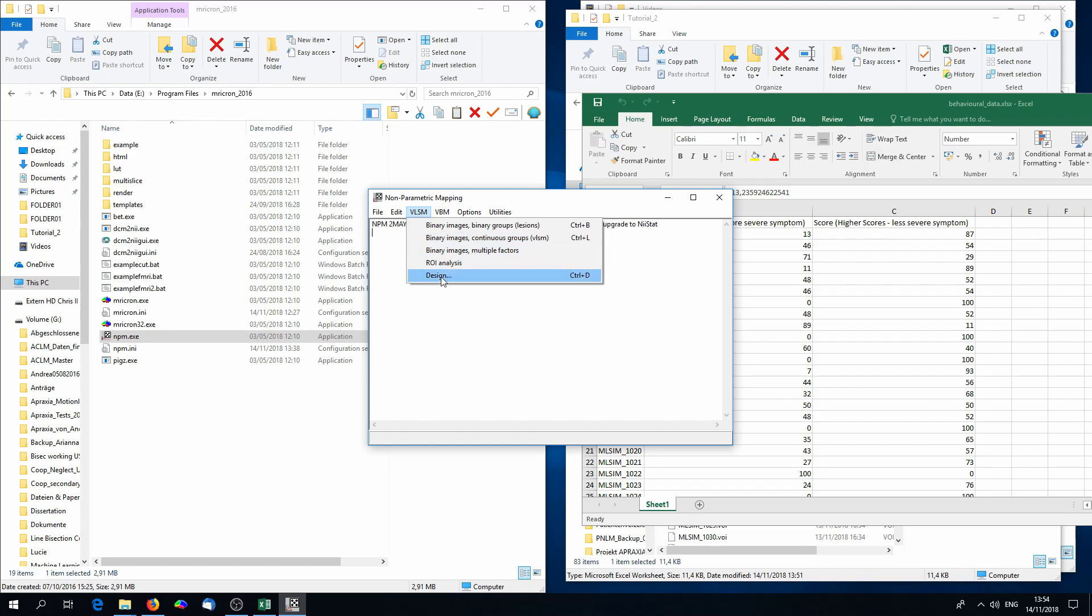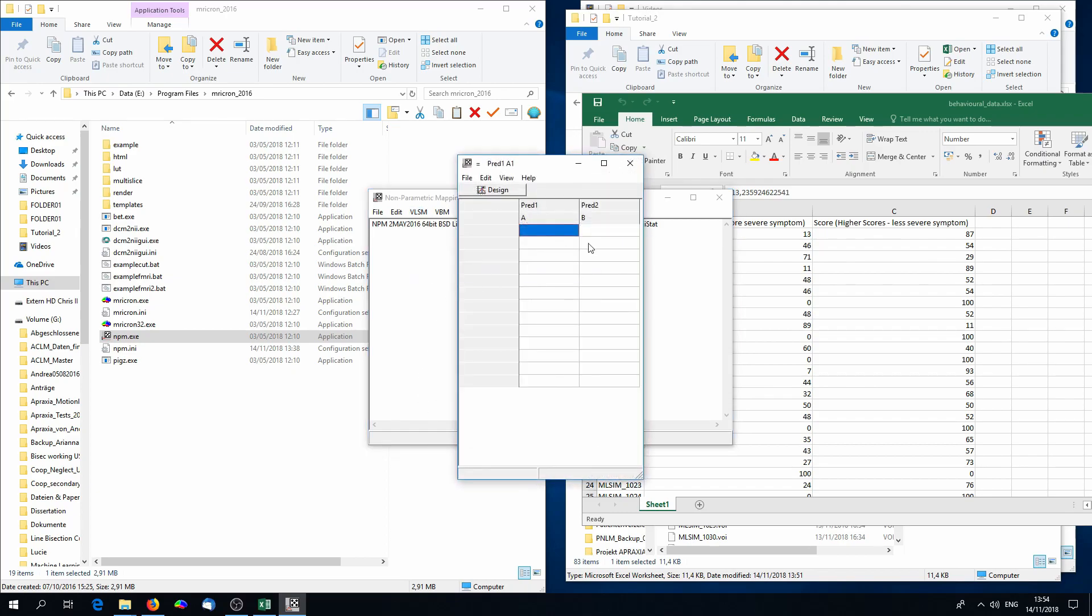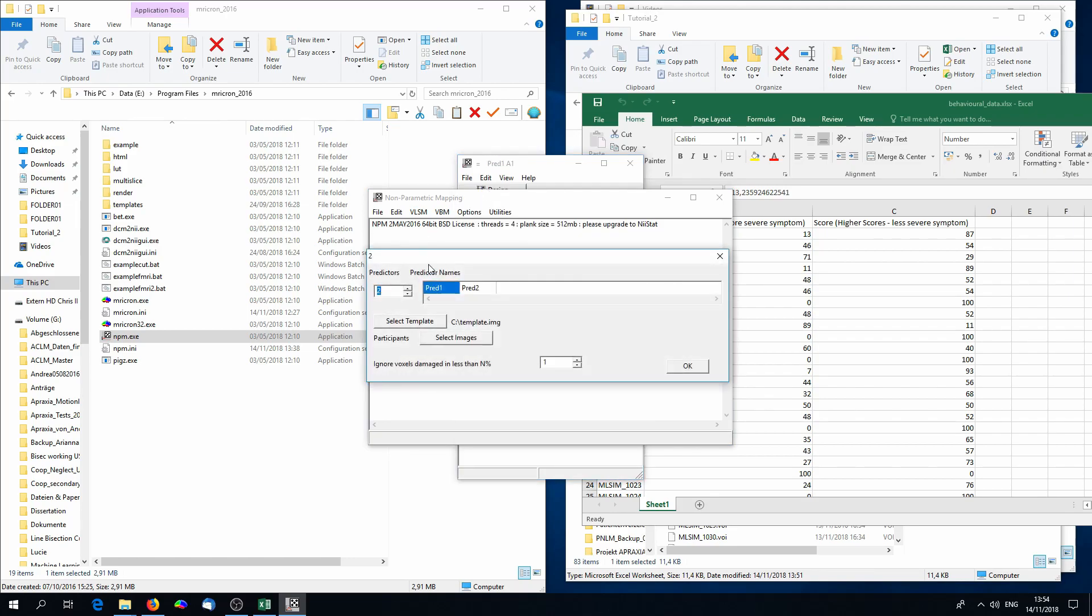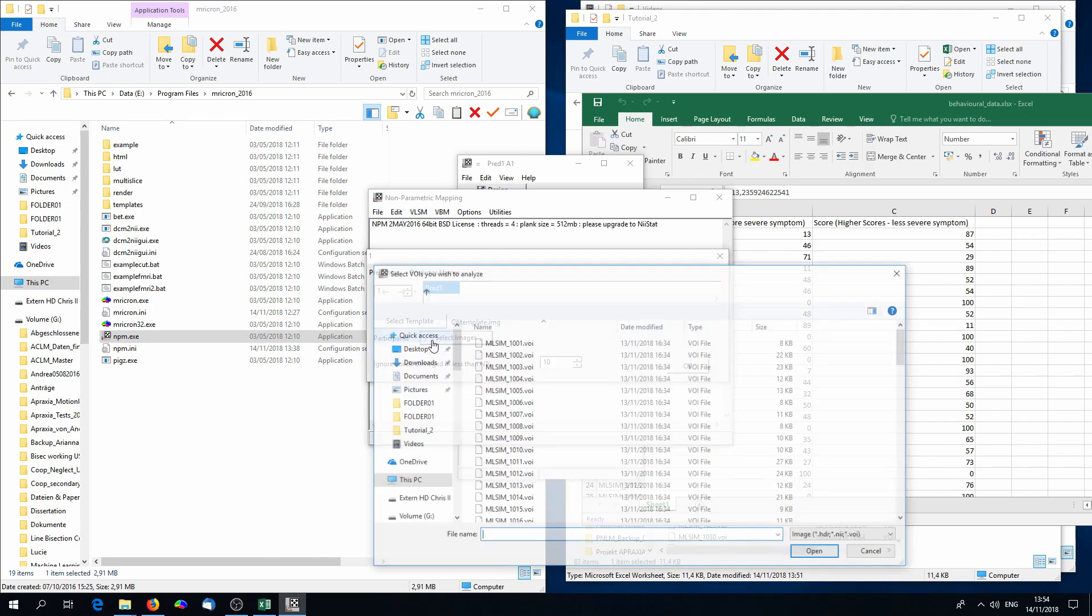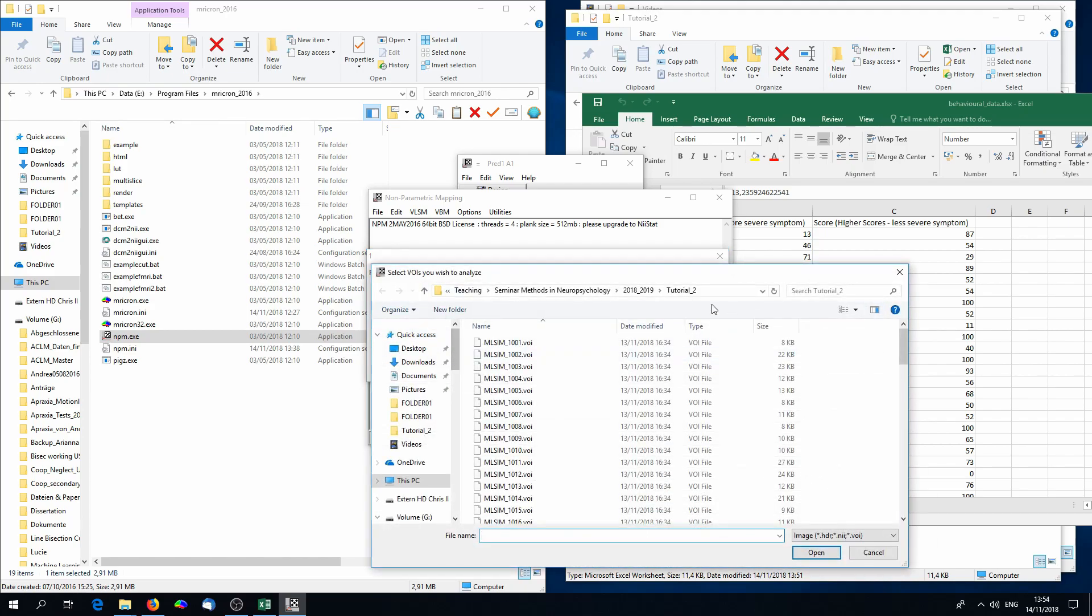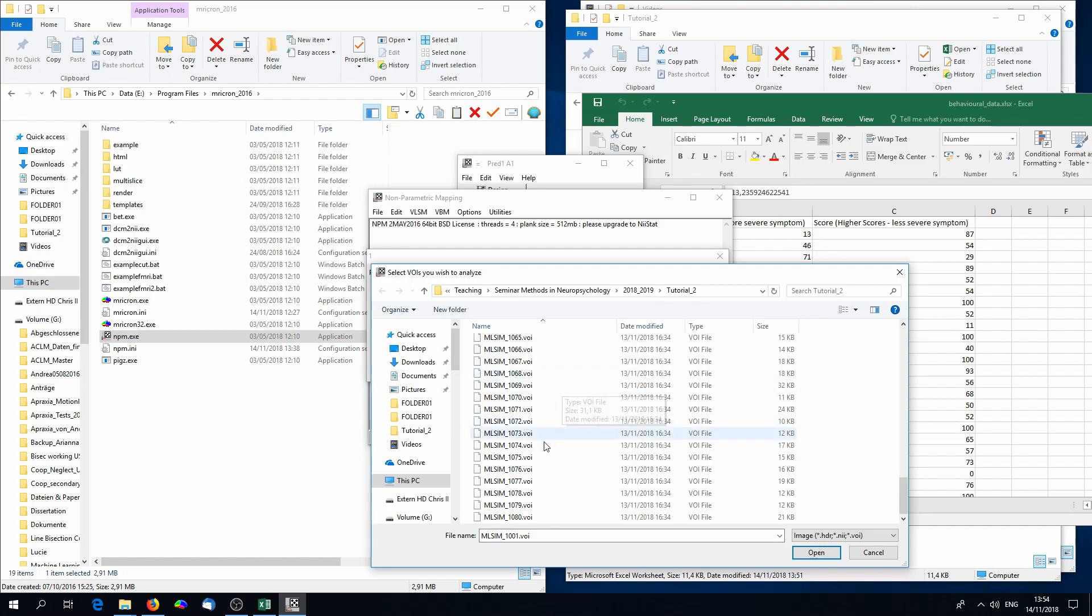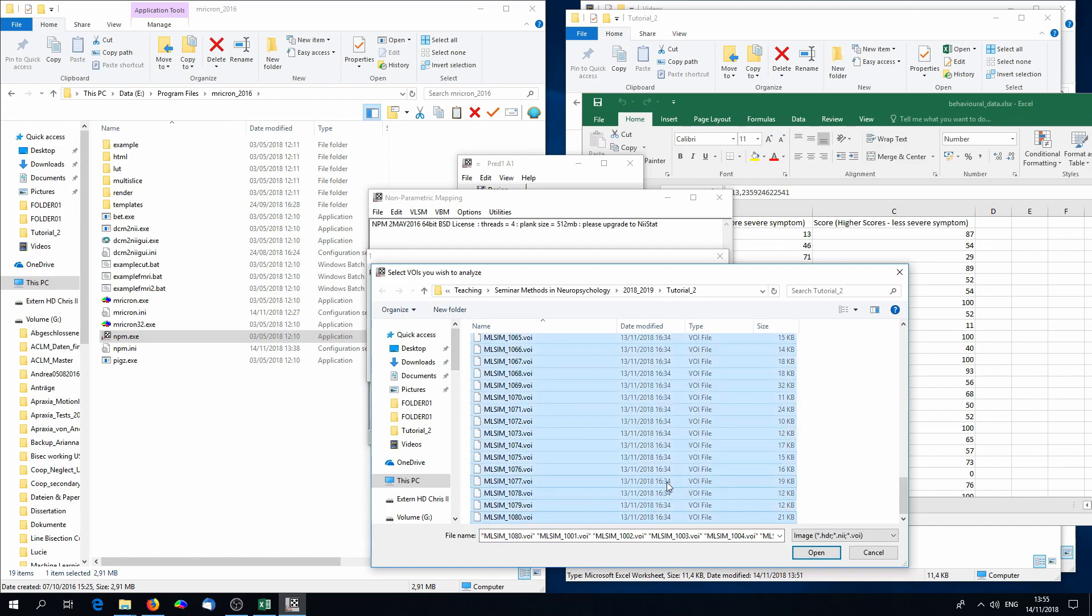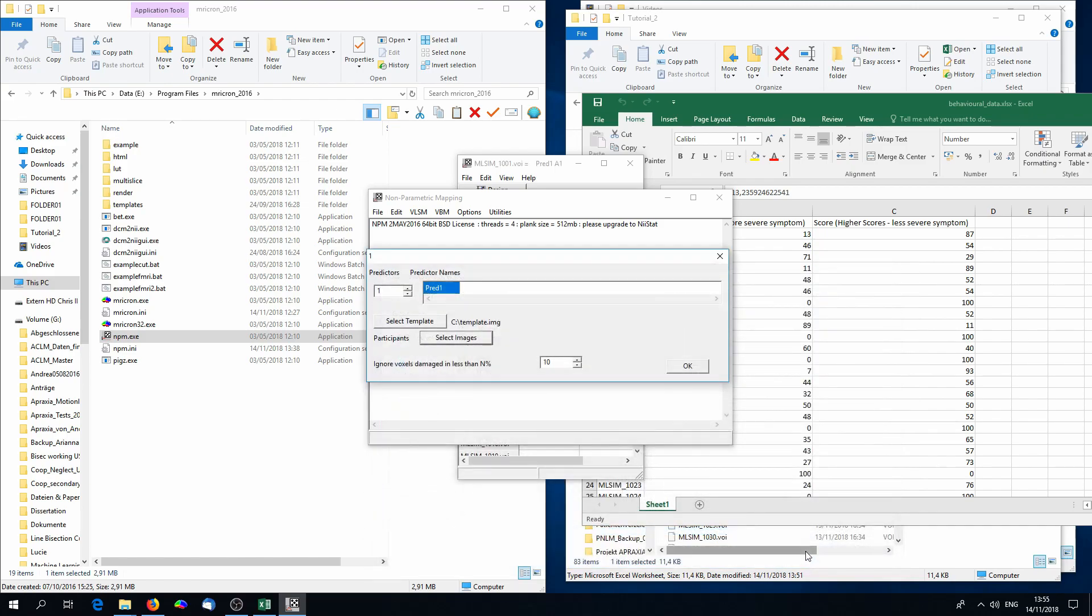First of all, we have to set up the design. Click on VLSM design, and click again on design. There, you first of all have to select that we only have one predictor, and you have to choose how often a voxel has to be damaged to be included into the analysis. You can just choose 10. Go on select images, and then choose all lesion images that belong to our analysis. So select all 80 images.